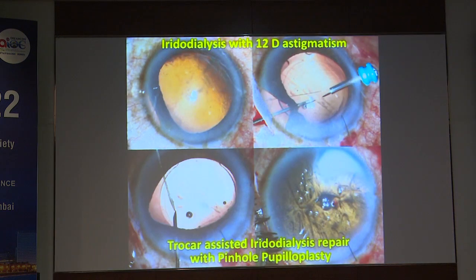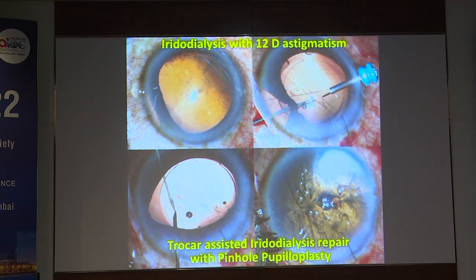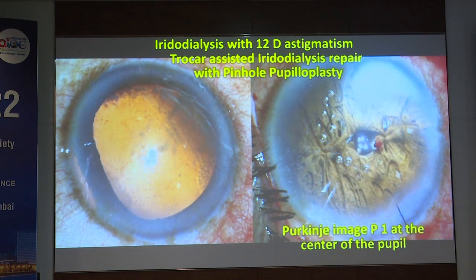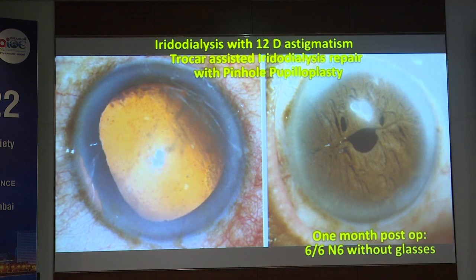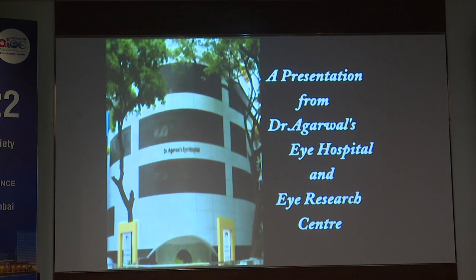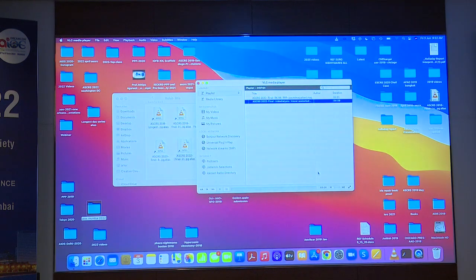After sealing the incisions — this case of iridodialysis with high astigmatism — the FACO, Trocar-assisted iridodialysis repair, and single-pass four-throw pupilloplasty were all combined as the two-fold technique, resulting in a pinhole pupilloplasty. One month postoperatively, the patient achieved 6/6 and N6 without glasses. This demonstrates the preoperative and one month postoperative result.